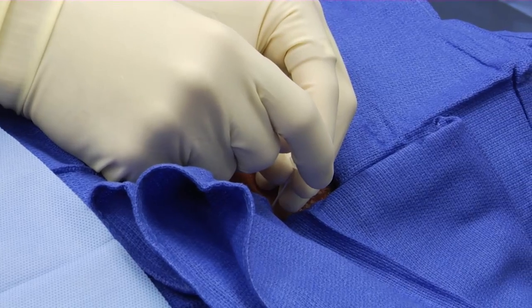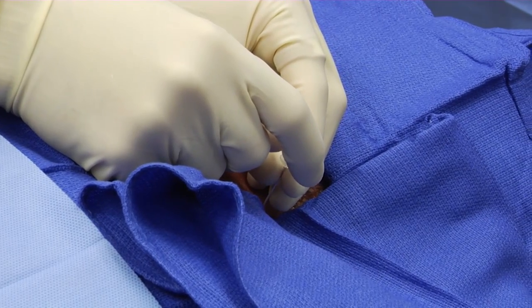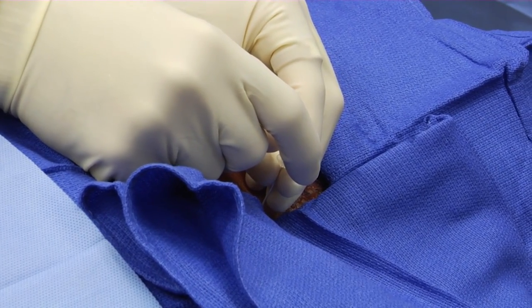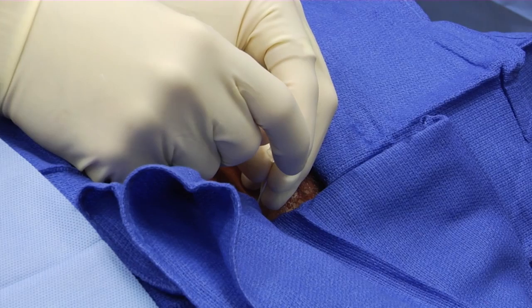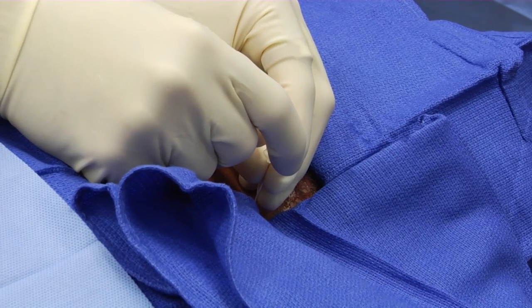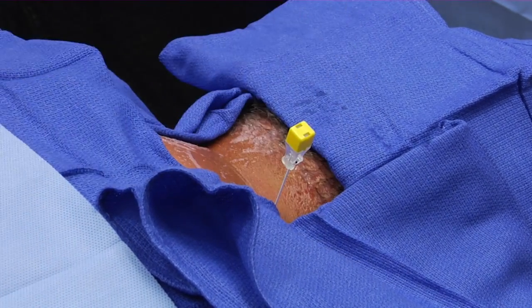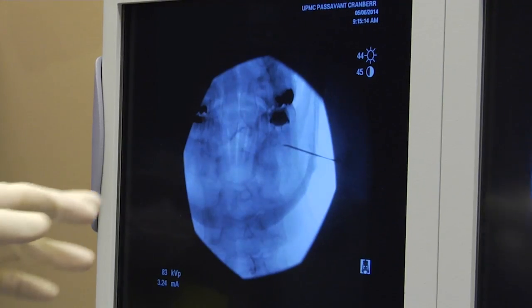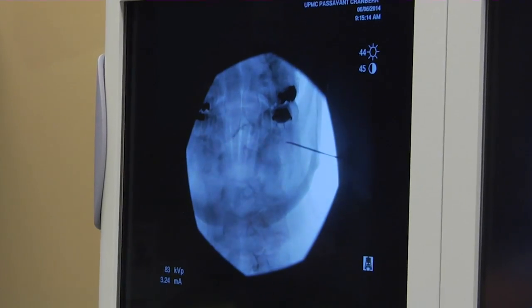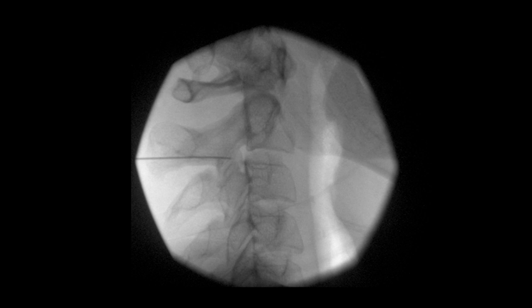After contacting bone, I turn the notch on my needle laterally, which allows me to walk off bone, then I turn the notch back to its initial starting position. On the lateral view, the needle is ideally positioned in the midpoint of the C2 and C3 facet joint line, posterior to the neuroforamen.